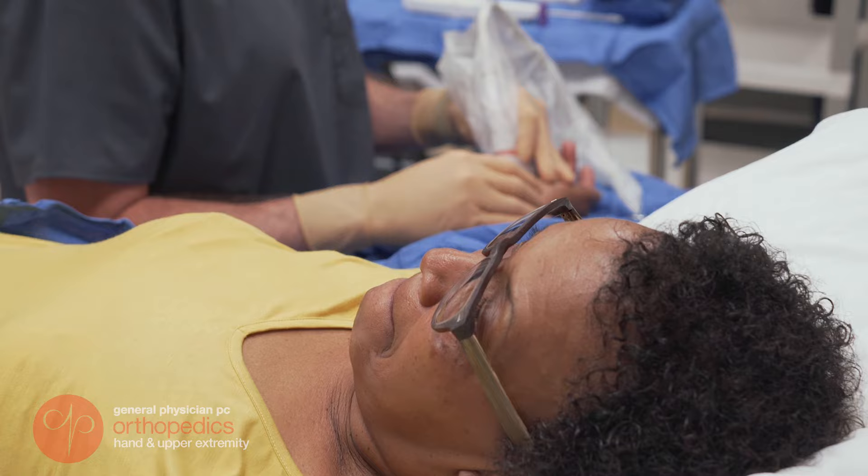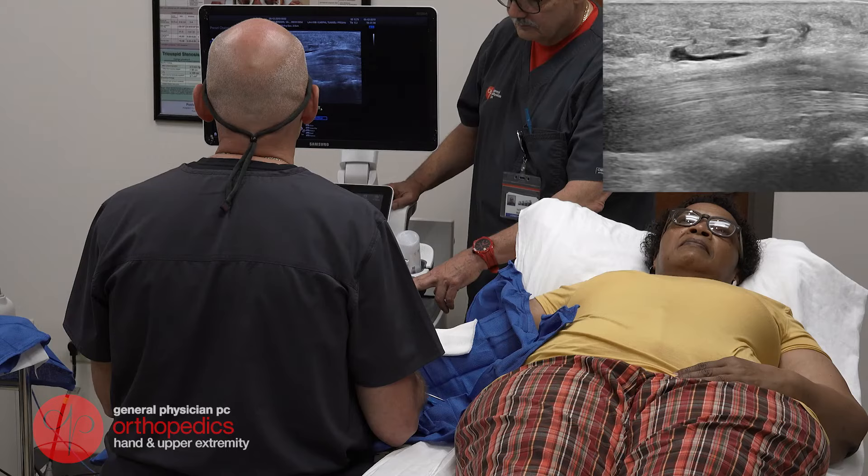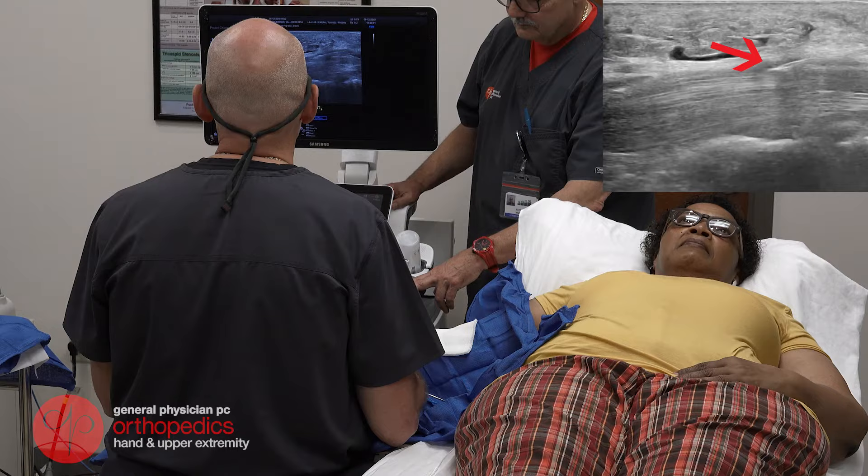The next step is to insert a needle into the carpal tunnel using ultrasound to guide us. Once the needle is in proper position, I'll put more local anesthetic into the carpal tunnel. This ensures that you're not going to have any symptoms while I'm doing the procedure itself.